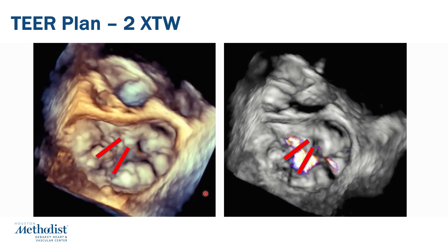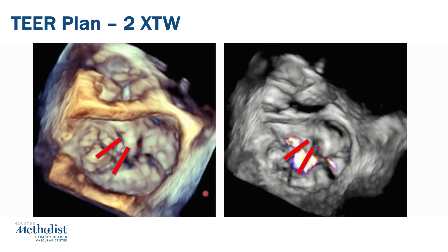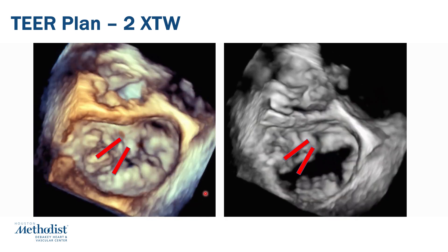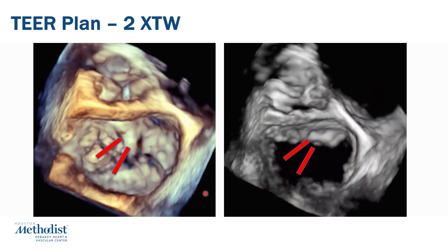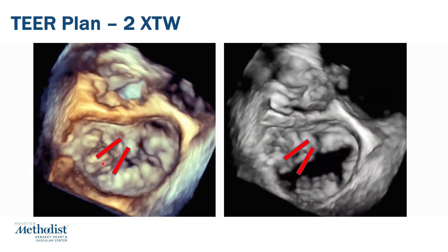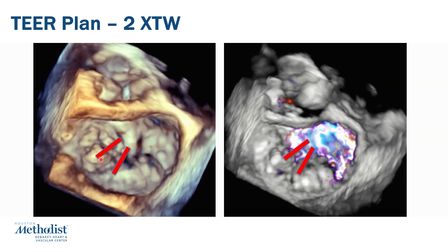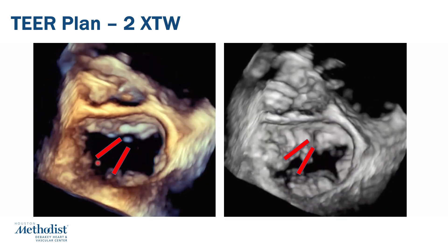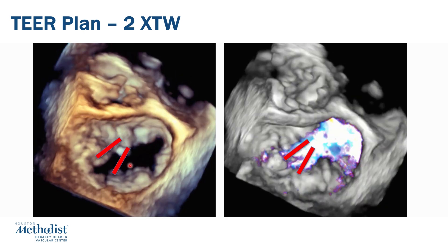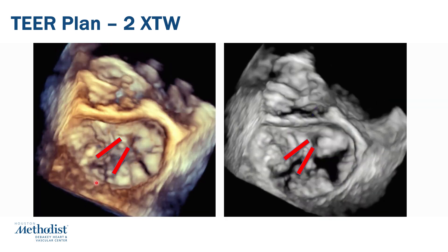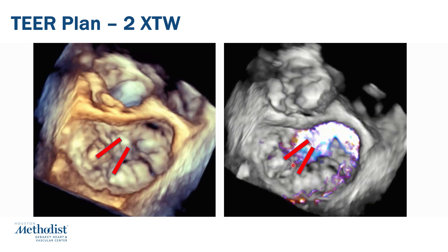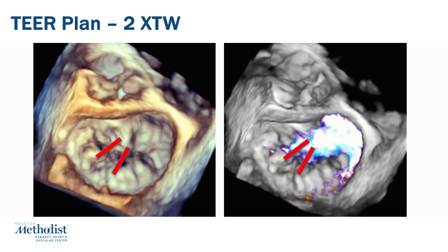This patient was felt to be a high surgical risk candidate at our center, and our plan was to consider edge-to-edge repair. Based on careful discussion with our imaging team, we felt we could position two clips — one from the P1 scallop of the posterior leaflet to the A2, perpendicular to the line of coaptation, and a second clip medial to that, from the A2 to the P2 scallop region. This is the corresponding color 3D representation of our clipping plan.